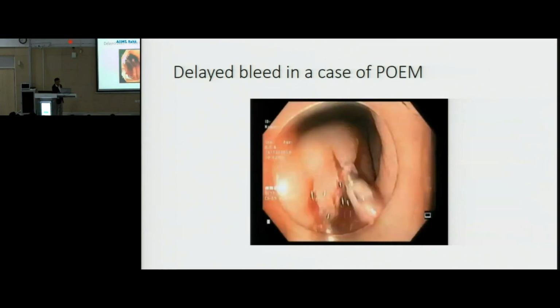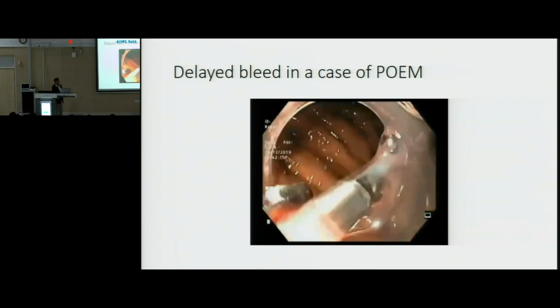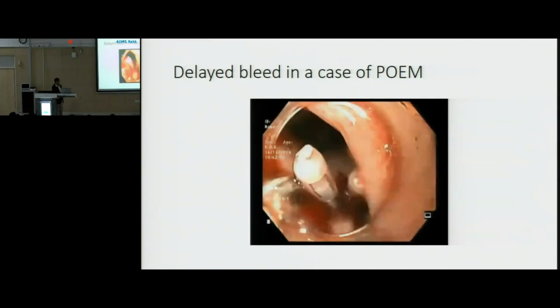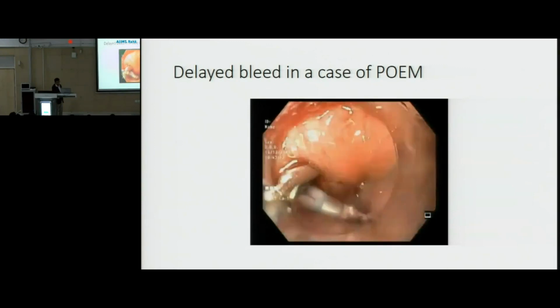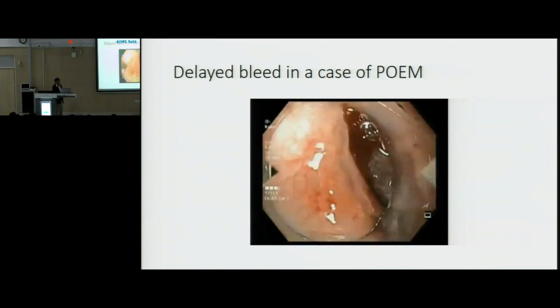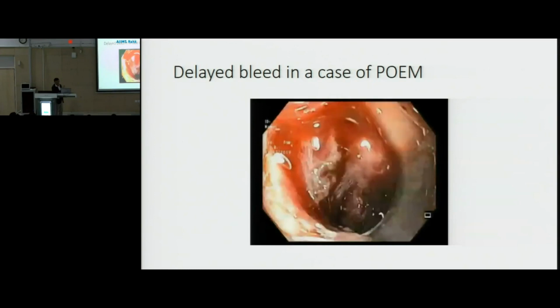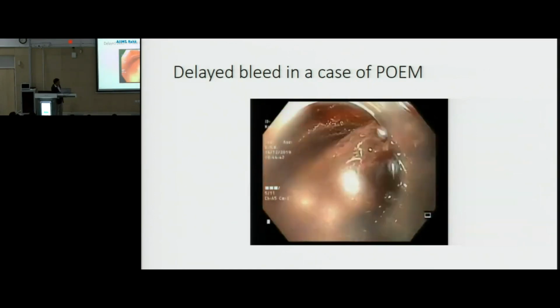We had to intervene in this patient because the patient was actively bleeding. By the time we did endoscopy, if the bleed had stopped, then we would not have intervened. There was not much Hb drop, only a 1.5 or 1 gram drop. But still, because in endoscopy we saw active bleeding, we had to intervene. So we took out all the clips. It's very easy to take out the clips. With the rat tooth forceps, if you just catch hold of the clips, they will come out. And we entered the tunnel.